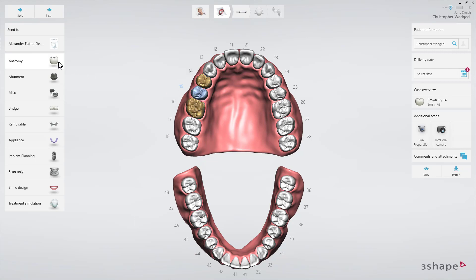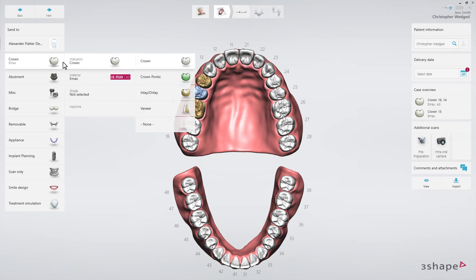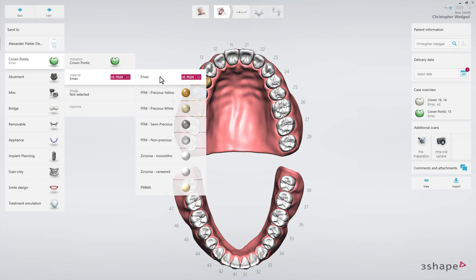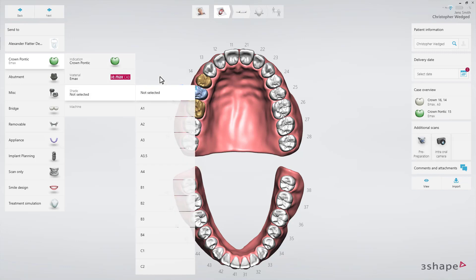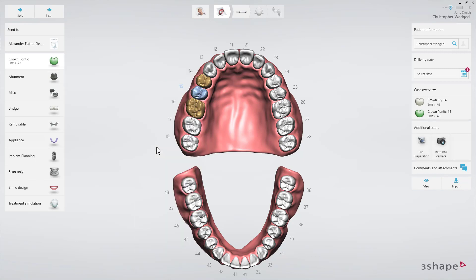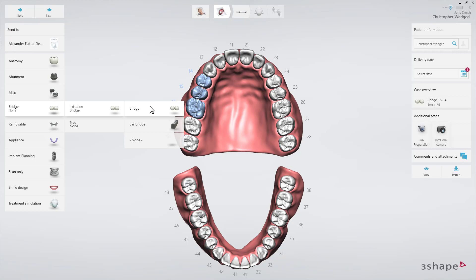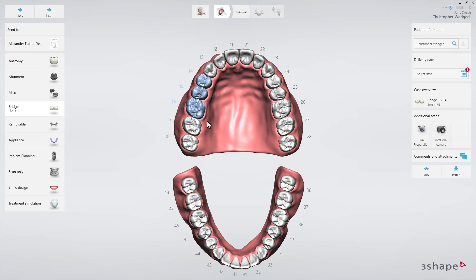Now select the tooth for the pontic. In the anatomy drop-down list, select crown pontic. Select the material and shade if needed. Now mark all the teeth comprising the bridge. From the bridge drop-down list, select bridge. Finally, set the delivery date.